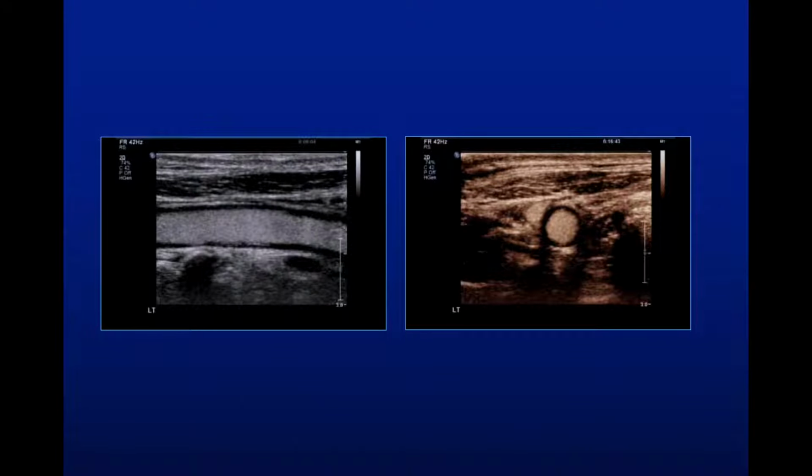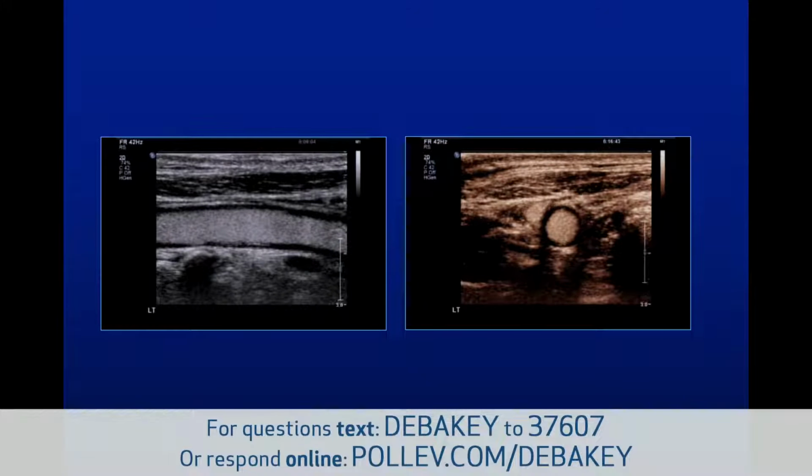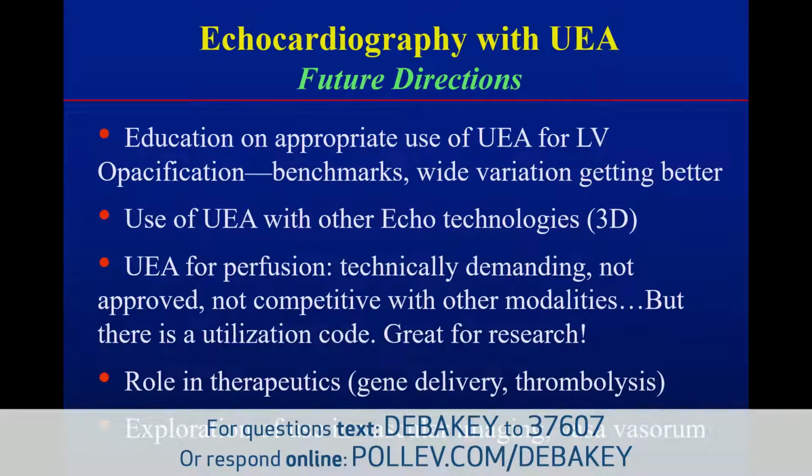And last, I want to discuss something that we don't talk much about in echocardiography per se, which is enhancing the vasculature, visualization of the distal vessels, and if you have stents in vessels and in the aorta. I think this is not in our direct realm, but people have used that, imaging vasa vasorum. So I wanted to conclude with a few things.